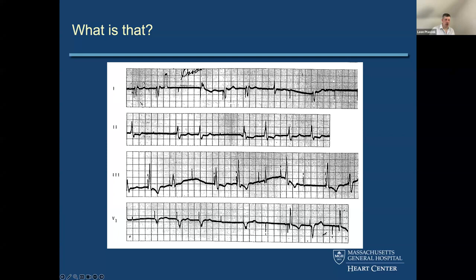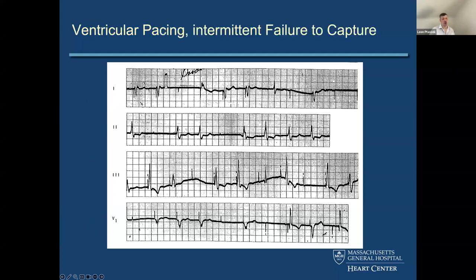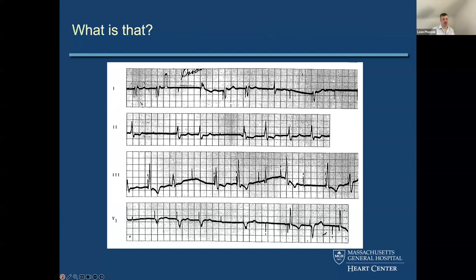Well, okay, going across from the top, here are four different leads. And again, four different leads, but they're not in time with one another. So it's sort of like continuous switching between leads. And again, this is a really old tracing.